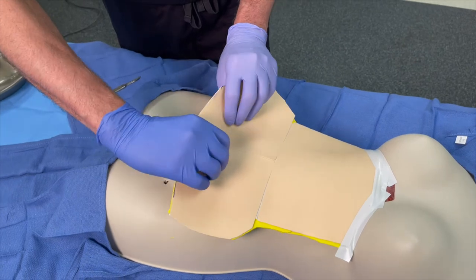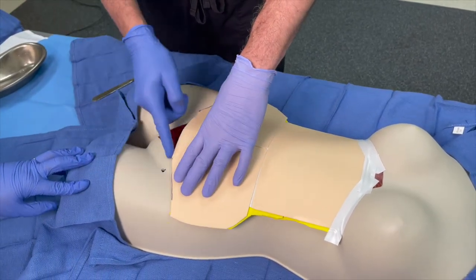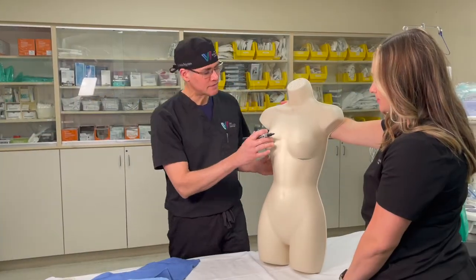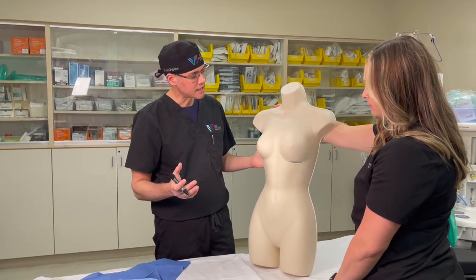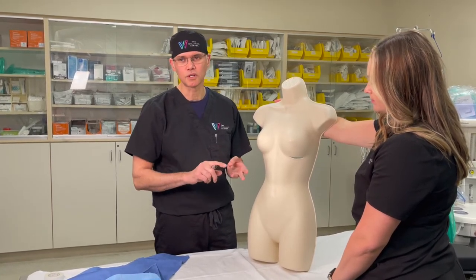Once we've removed that excess skin, we pull down and tighten up and close with the incision really low in the bikini line. Now I'm going to be demonstrating my different approaches for a breast augmentation. One question I get asked a lot is where are the incisions for a breast aug, how long are the incisions, and what are the different approaches?